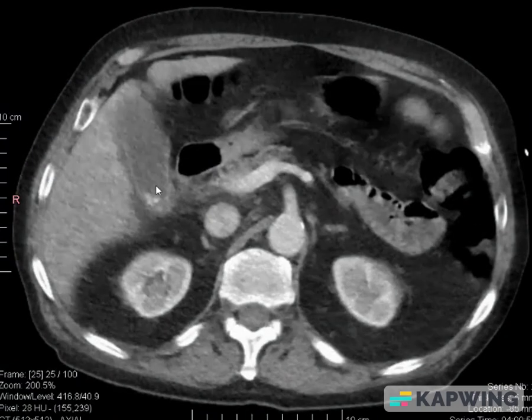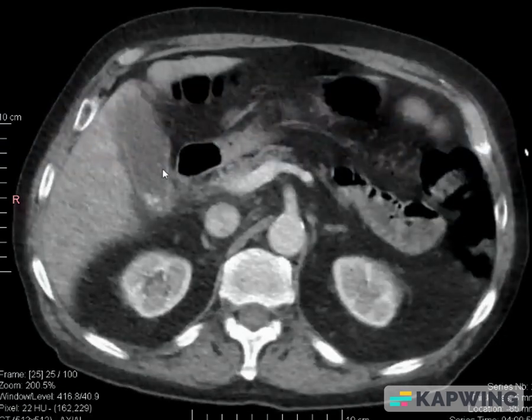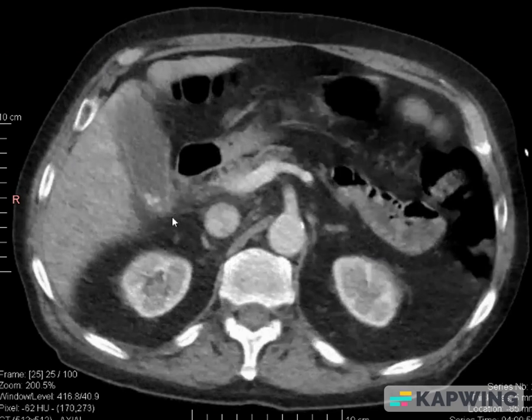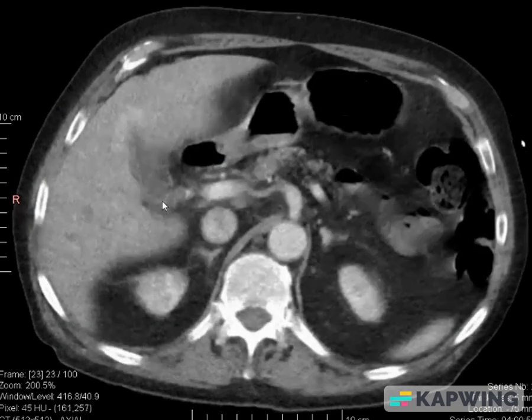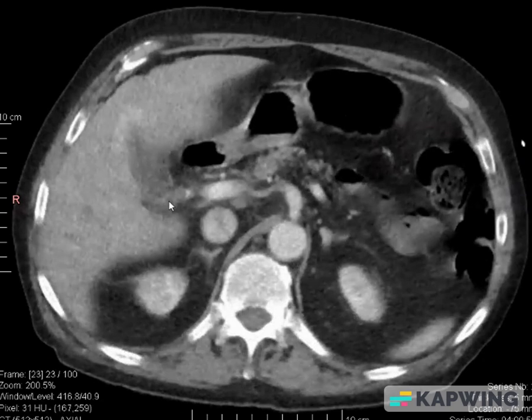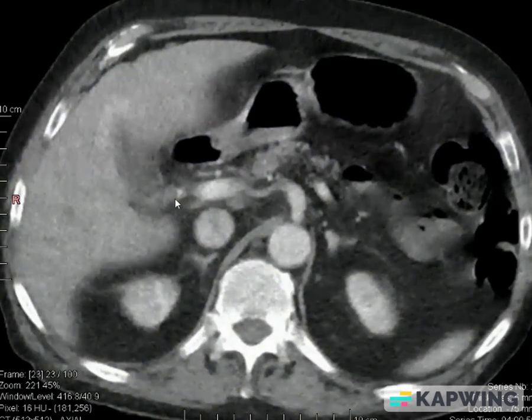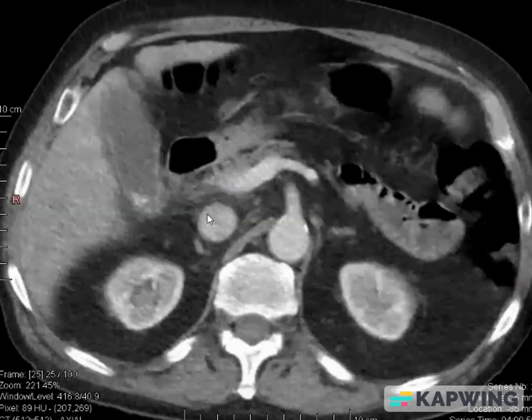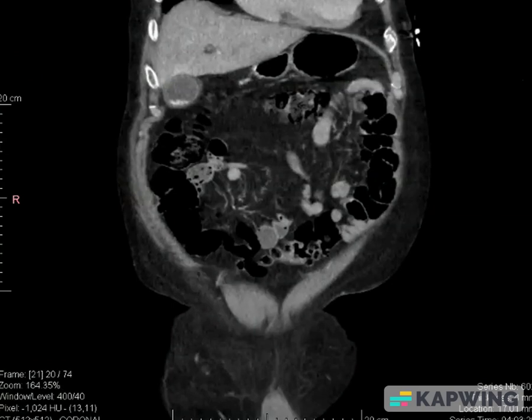Here you can see the gallbladder is distended with wall thickening and pericholecystic fat stranding, and some intraluminal hyperdensities representative of calculi are present. Then you trace the cystic duct — this is the cystic duct — and if you trace it, you can see a hyperdense focus within it. So there is a cystic duct calculus as well.